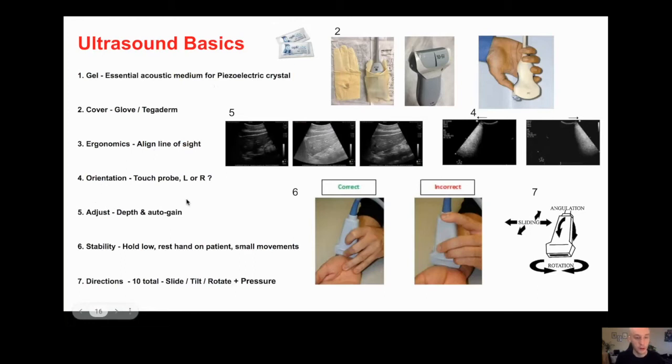There are a lot of knobs on the ultrasound machine, and they can look intimidating, but they needn't be, because there are only two that you really need to know: depth and gain. You can't see it that well here, but on this screen there are depth markings and a total depth down here. Let's say this is 2 centimeters, and the markings are going to be 1.5, 1, 0.5, and 0. This is the surface. So you can adjust the depth.